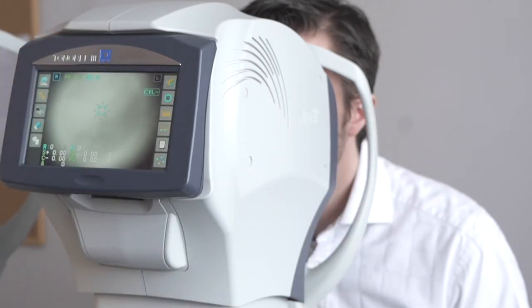To do that, we can adjust the height of the table or use the chin rest adjustment on the base of the machine.